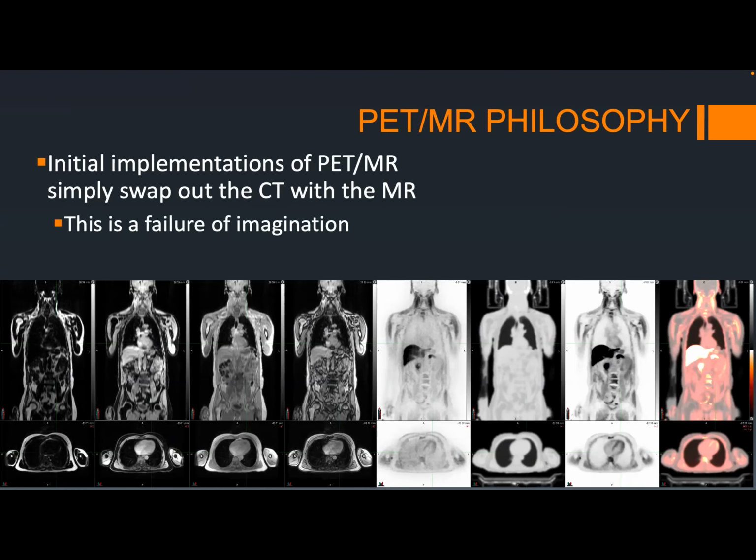In fact, that's how their software is built. And I think that's a huge failure of imagination, because it's not using the machine for what it can do. And that has led me to build more difficult to execute protocols, but I have managed to do it, protocols that really show off what the machine can do.